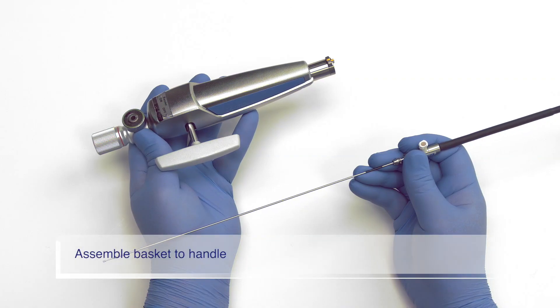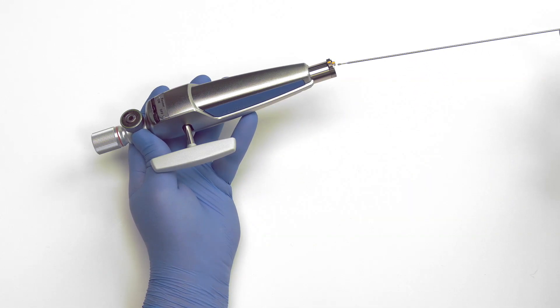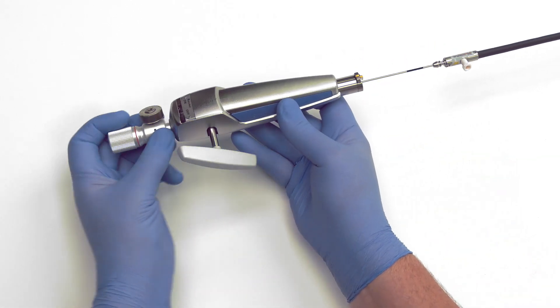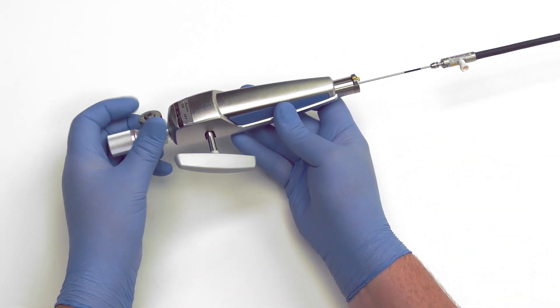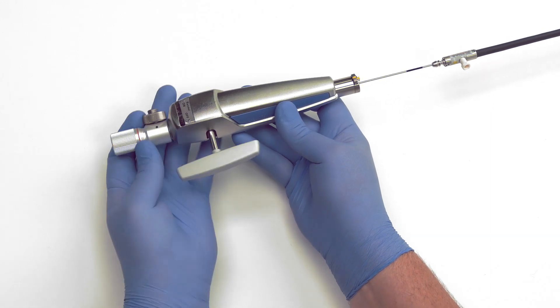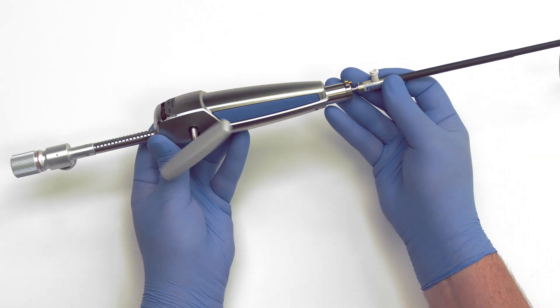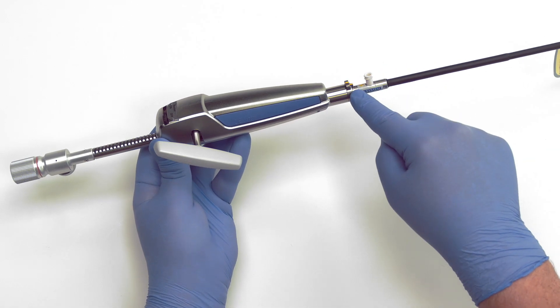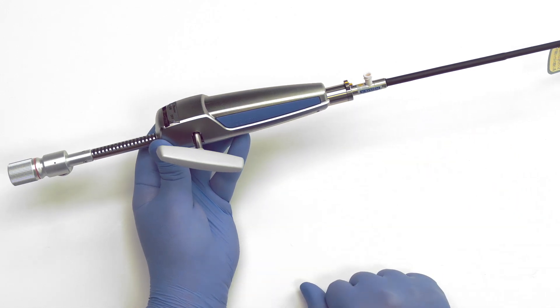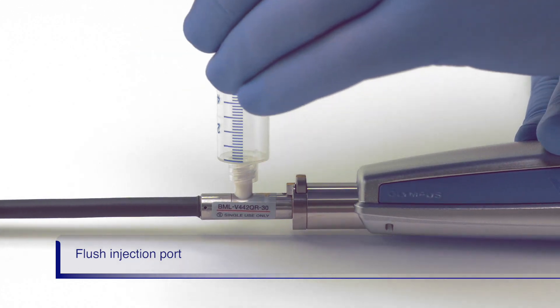Next, we will assemble the basket to the handle. First, insert the stem into the handle until you feel or hear a click. Lock the stem in place by fully turning the knob on the release button clockwise. Next, we need to align the yellow arrow on the end of the basket to the yellow marks on the handle. Push the basket end into the handle until you feel or hear a click. Flush the injection port prior to passing the basket into the scope.